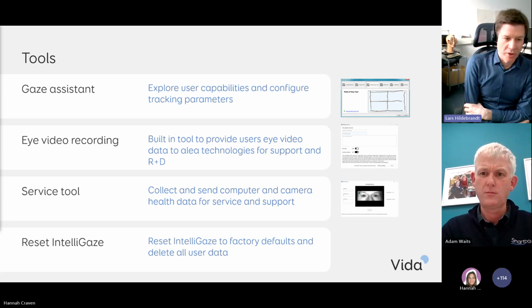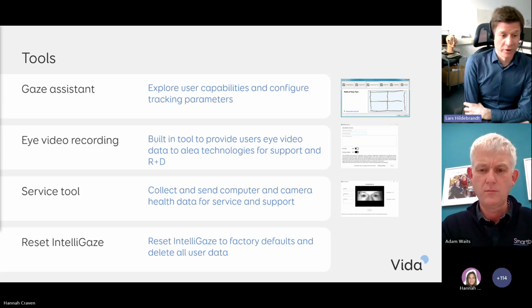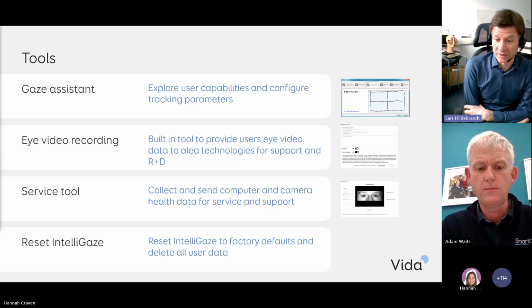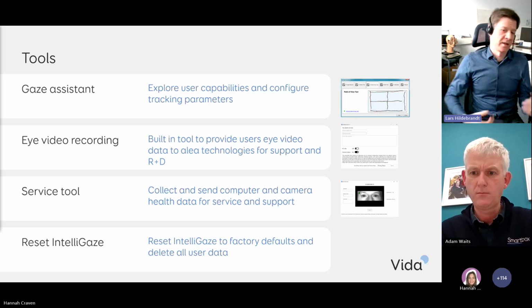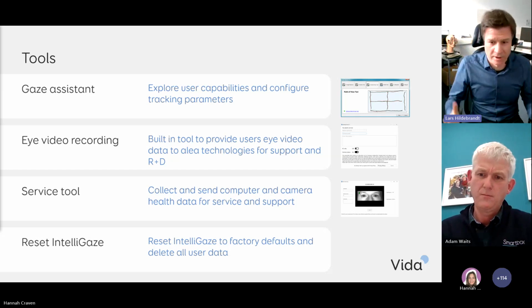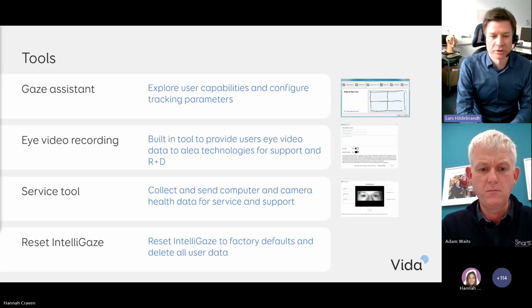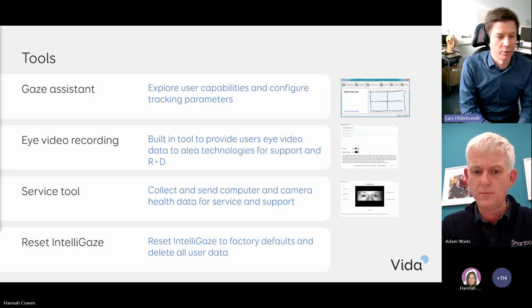Eye recording tool, I just mentioned it. You will find it under options and help. You do this if anything fails, and you and we all want to learn something from this particular case and maybe provide a solution to something that we haven't seen. An example, if you have a user who has a ventilation mask, just one eye visible, laying in bed on the side and has an eye surgery. This is very special, maybe new, and we can train the tracker to this particular case. And there's a chance that we can do this.